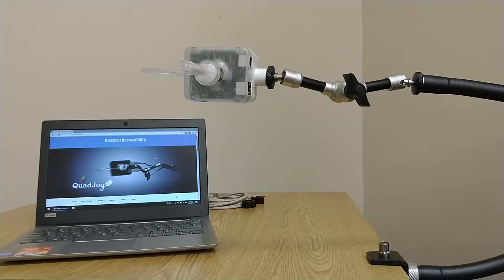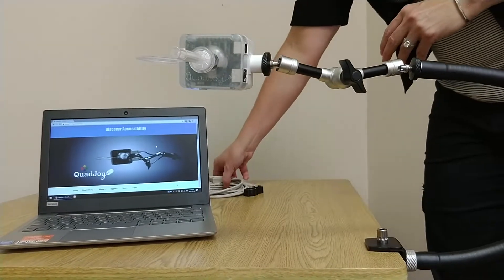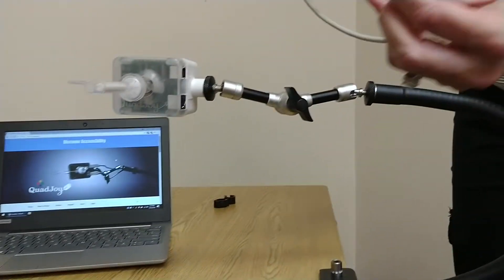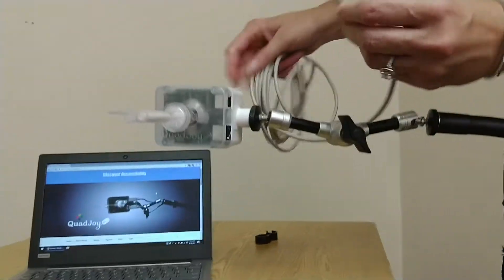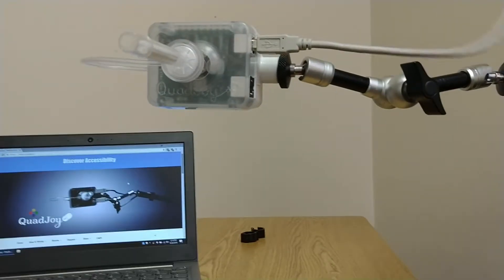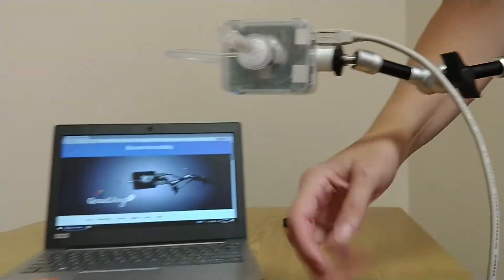Now connect the USB cable to the Quad Joy, the square end of it. Plug the other end into the computer, the rectangular end.